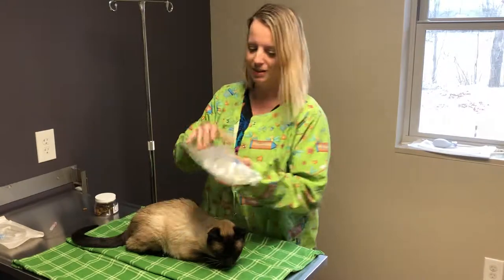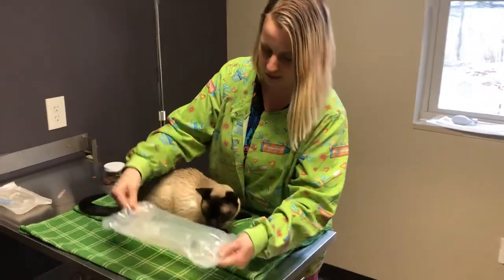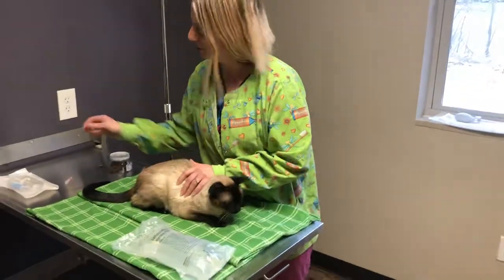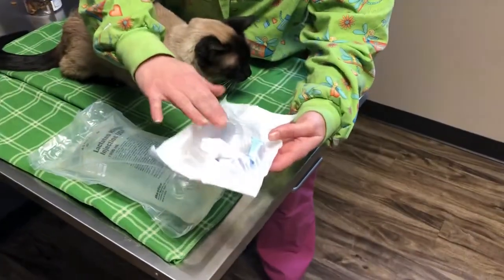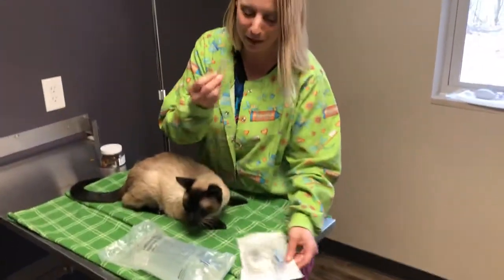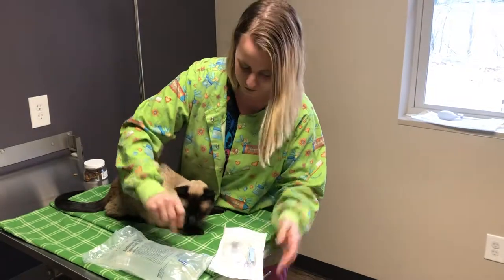So this is a bag of fluids — we're going to do lactated Ringer's. I like to get everything together before starting fluids. This is a line that the veterinarian will send home with you and it's going to hook up to the fluids. And then of course the scary part is a needle, but I'll show you and hopefully it'll be less scary for you at home.